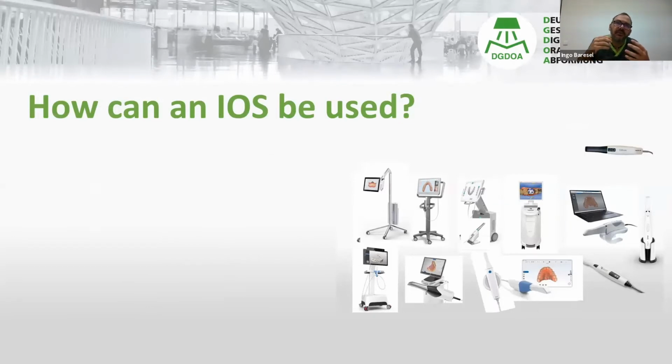But there are many differences between intraoral scanners. And we'll talk about this because this is even a reason why people don't go digital, because they don't know what scanner they should buy. So I will show you a little bit the differences between the scanners. There's not just the best scanner on the market. No, there are different scanners and every scanner fits to some offices. So you have to find the scanner for you. And you have to think about, what do I need? And then you will find the best scanner for your choice.